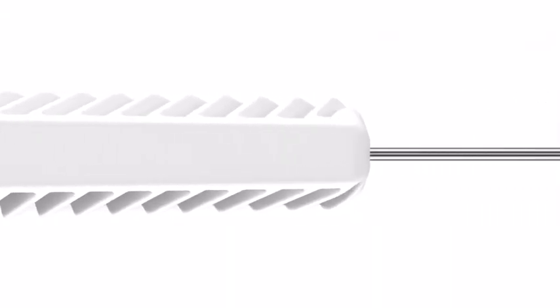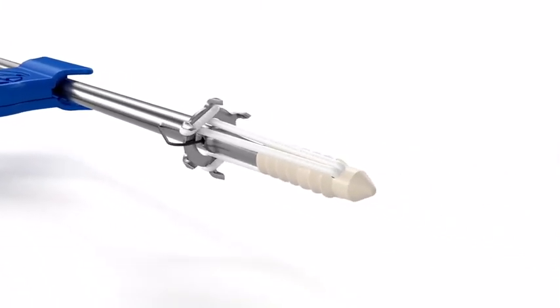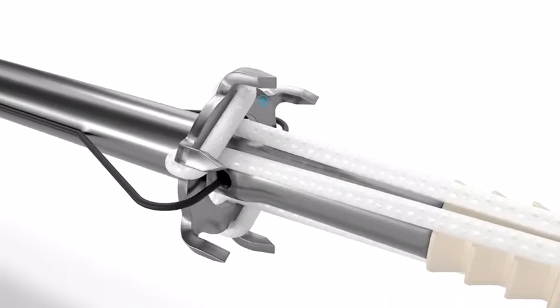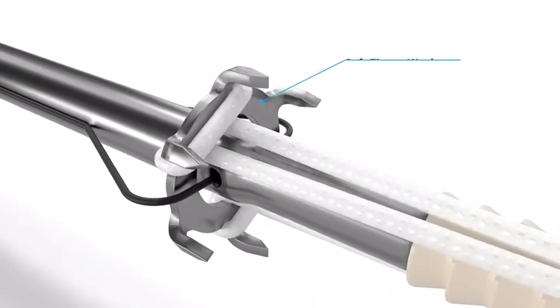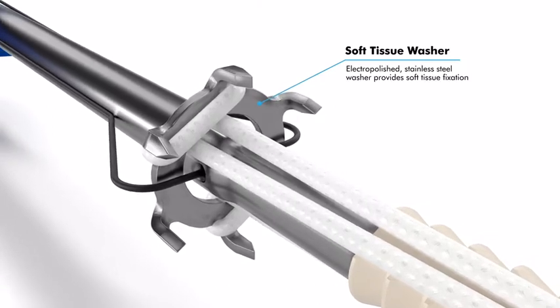The Coronet Soft Tissue Fixation System is designed to provide simultaneous, strong and secure soft tissue to bone fixation. During deployment, the implant simultaneously engages soft tissue and bone, eliminating the need for knot tying, thus streamlining the procedure.